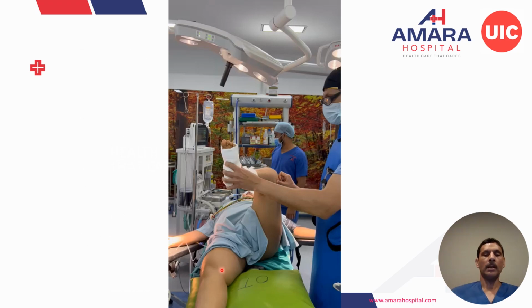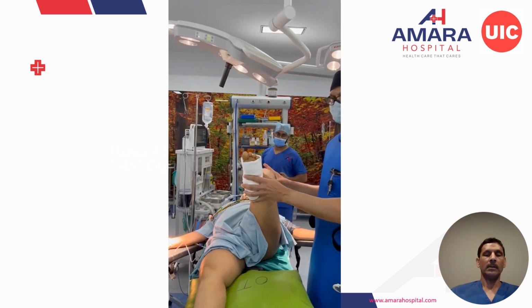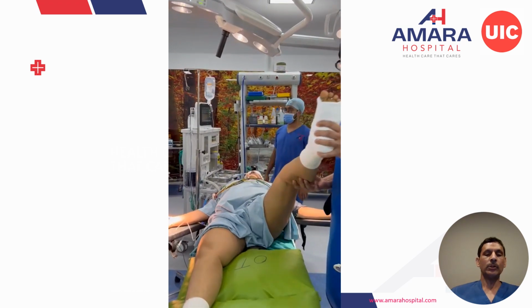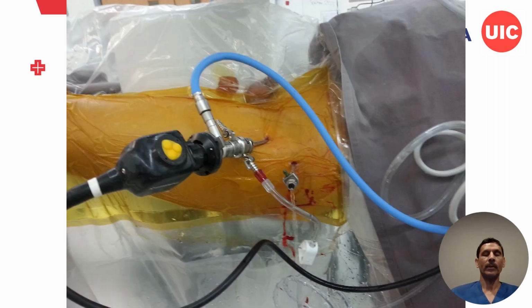Here's the intra-op exam under anesthesia. Max rotation is minus 10 to 15 degrees. She does not even go to zero. Here's arthroscopy. Starting portal, adequate distraction, putting the needle through the lateral aspect where it's the safest to enter. It's typically 2 portals. This is the anterolateral portal we made with the needle. Then while visualizing through this portal, we made the second portal. Now I'm going to show a video of the case.